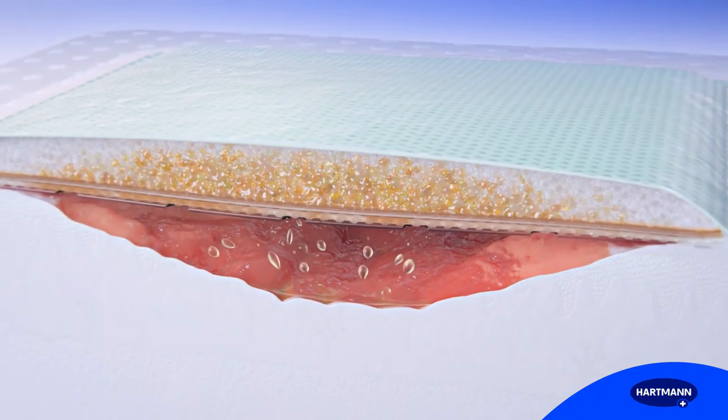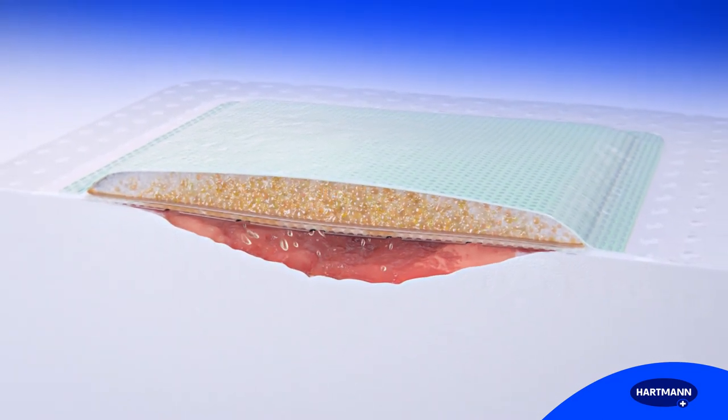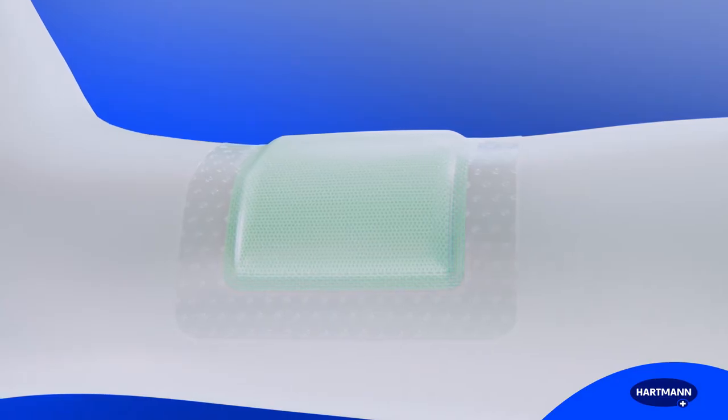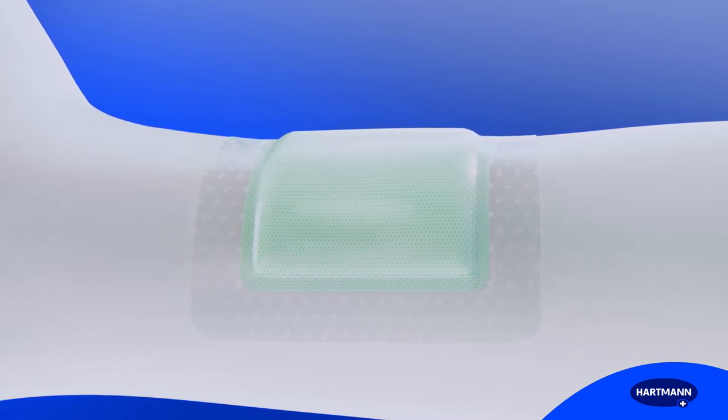Zetuvit Plus Silicone Border offers high absorption and retention capacity and an optimal microclimate. For patients, the structure of the core offers comfortable padding and protection against mechanical shocks.